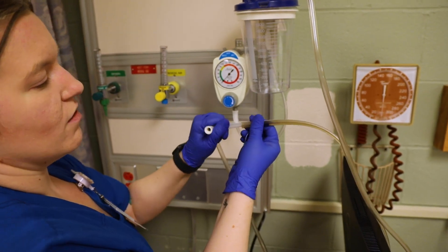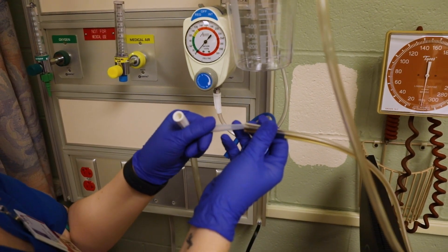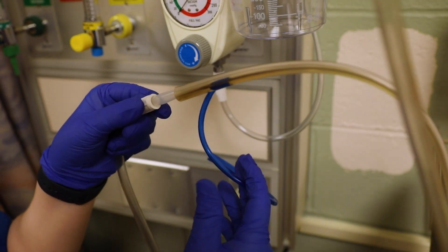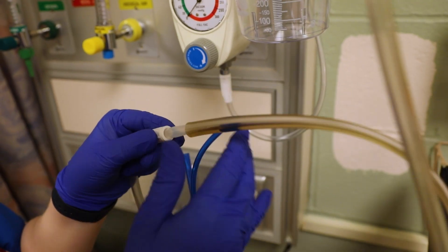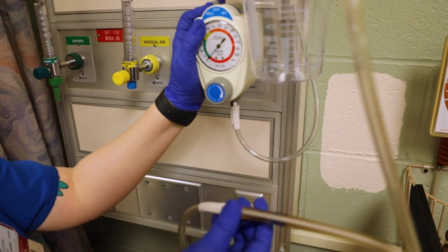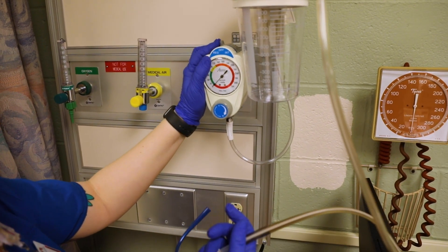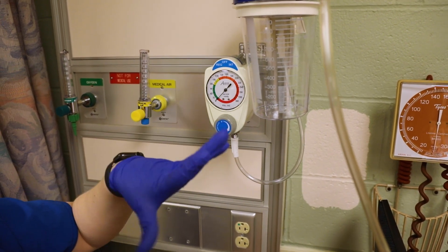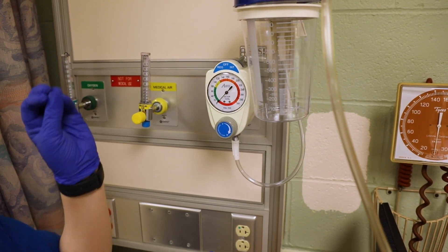If you watched the NG tube insertion video, I mentioned keeping this little plastic piece. You put the plastic together like this, and it can be used to help suction from the NG tube. When you suction from an NG tube, you usually want it to be intermittent because it's going into the lining of the stomach. That's what 'INT' stands for — intermittent means it'll suck and then stop, and suck and then stop.